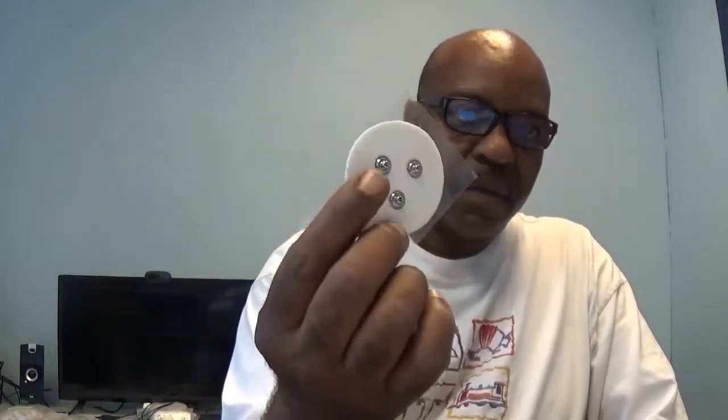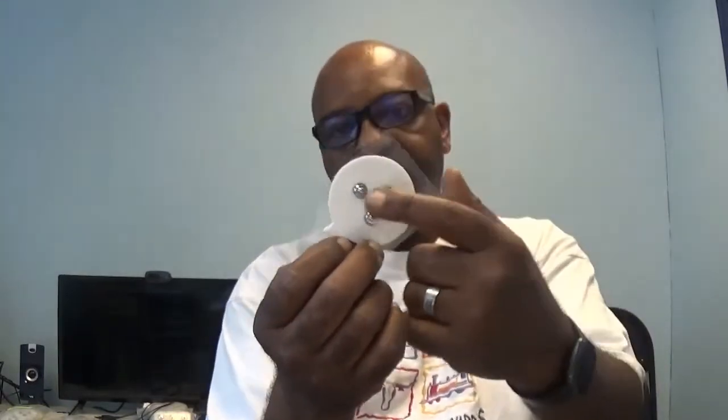So this is one called a Triode, and it has the 3 electrodes on one pad. They're close together, and you can see they're arranged in a triangle, so they're equal distance even though they're not in a straight line. Being that they're close together, that's what we would call a narrow placement. Narrow placement, the electrodes are closer together, so they're covering a smaller area of muscle, so it's going to be more specific to the location that they're covering than the surrounding area, especially if you're using a narrow filter, which is another thing we'll talk about more at another time. But basically these electrodes or sensors are close together, equal distance. This is a narrow placement.